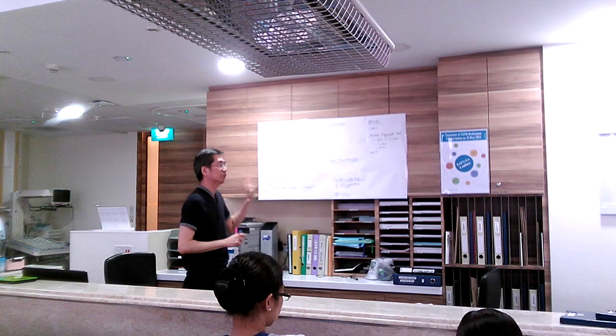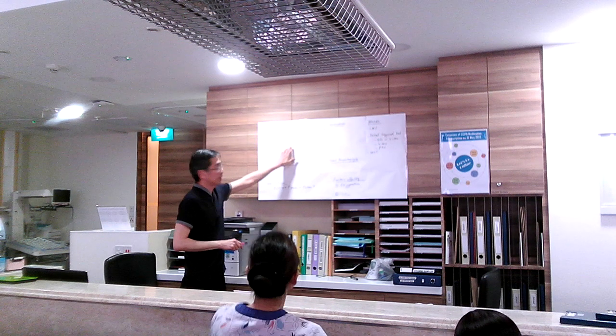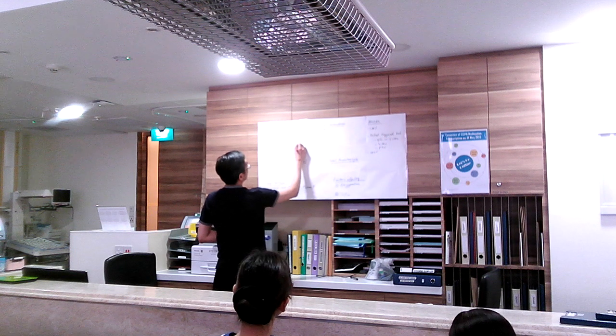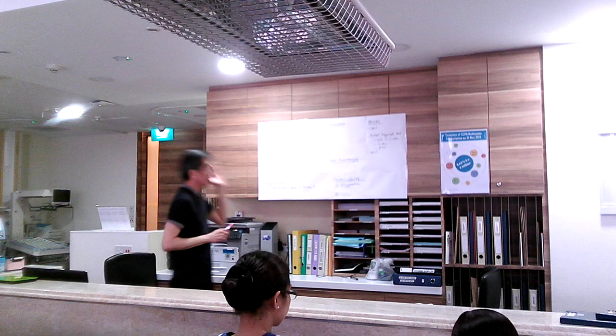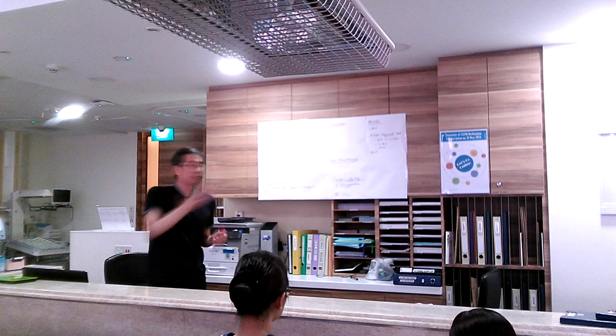Using flow to cycle off is a more complicated concept to understand, but that is essentially what pressure support ventilation, PSV, uses. PSV uses flow to cycle off. So you'll notice that whenever you put on pressure support ventilation, you don't have an I time.